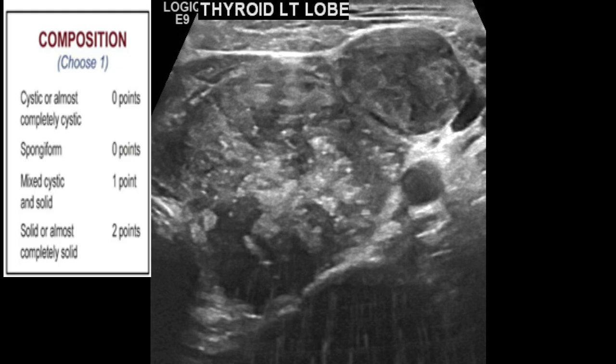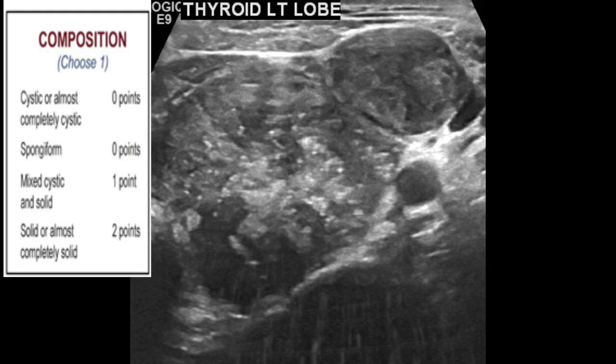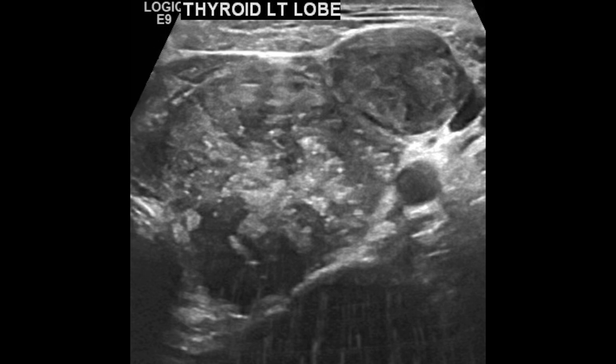First, we start with the composition of the nodule. Here we have a solid nodule, so we will give it two points for being solid. The second category is echogenicity.